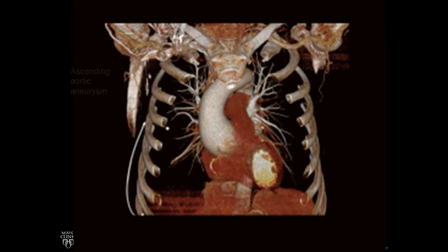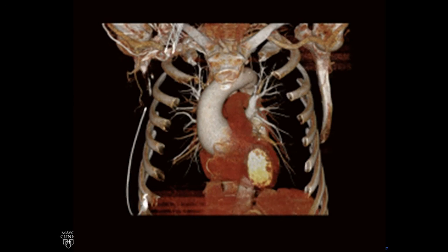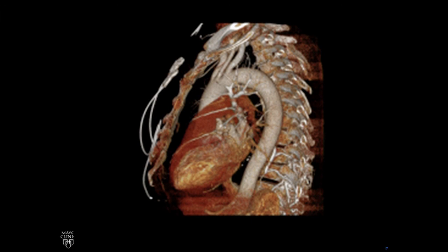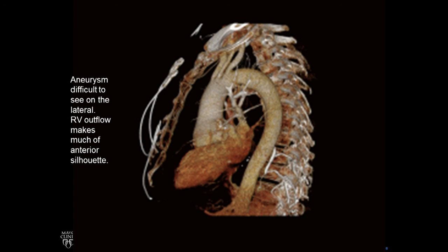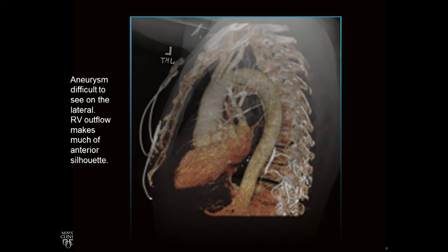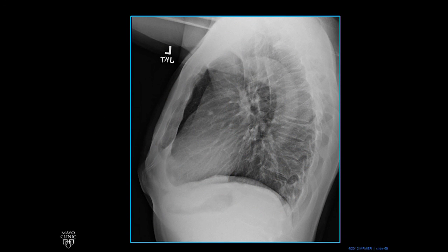Rotating back a little, there's our ascending aortic aneurysm. We rotate to the lateral, and the aneurysm is difficult to see on the lateral. The RV outflow makes much of the anterior silhouette. A lot of that is because this aneurysm especially is pooching kind of left to right, so it doesn't make a big impression front to back. When we pull up a lateral radiograph, it's not super striking.